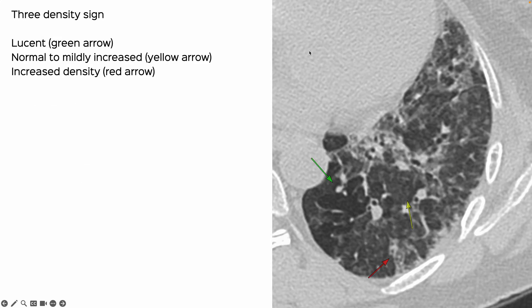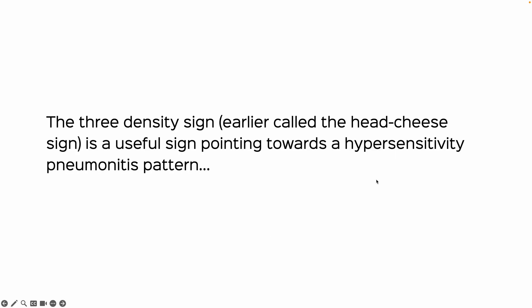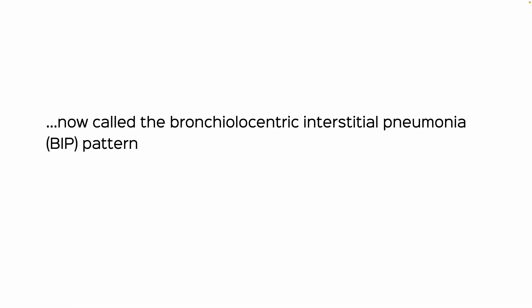We can see the three density sign here: there are lucent areas, this is slightly increased density — the earlier idea was to call this normal lung, but you could say it's just slightly increased density — and then this is more increased density. So that is the three density sign, which was earlier called the head cheese sign, and is a useful sign pointing towards a hypersensitivity pneumonitis pattern, now called the bronchiolocentric interstitial pneumonia, or the BIP pattern.